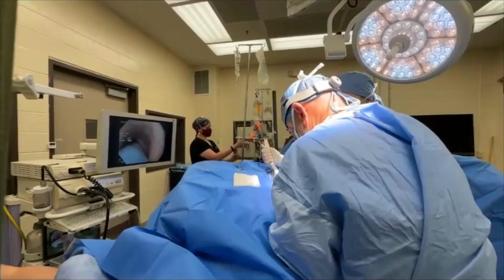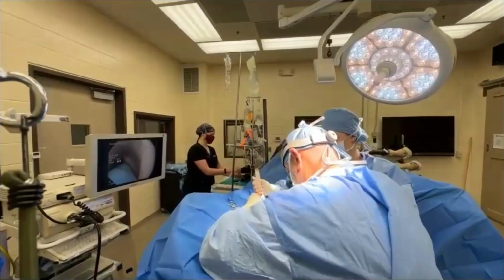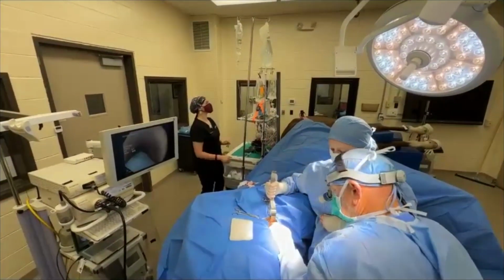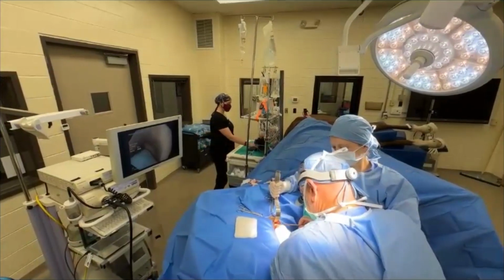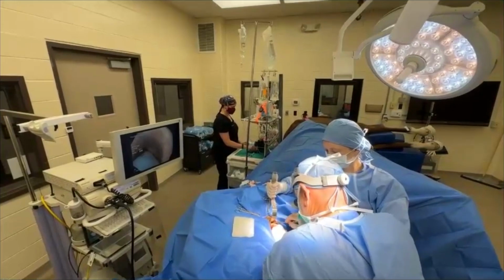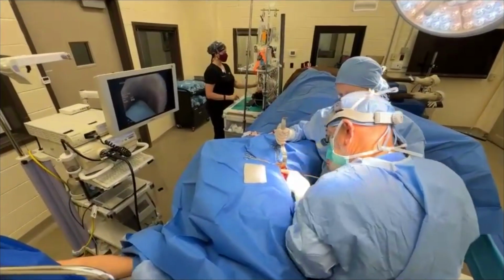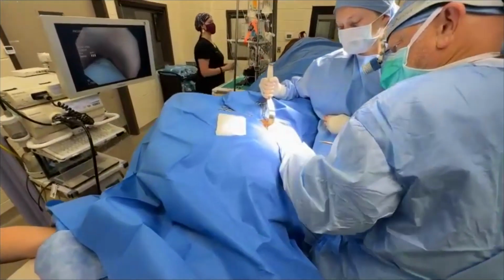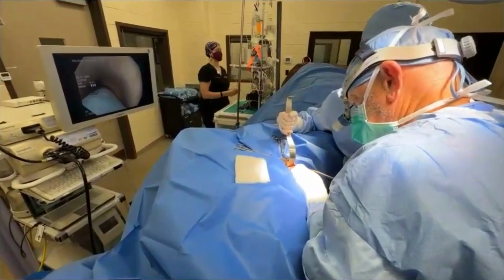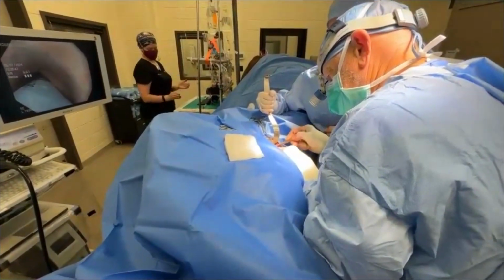And then usually most people use two sutures to do the tieback. There's varying techniques of how to do that. Just the term tieback really explains what you're doing. You are in the process of tying back one of those sides to open up that airway, if I assume correctly. That's exactly right. And perhaps we're not actually tying it back, we're tying it up and out.